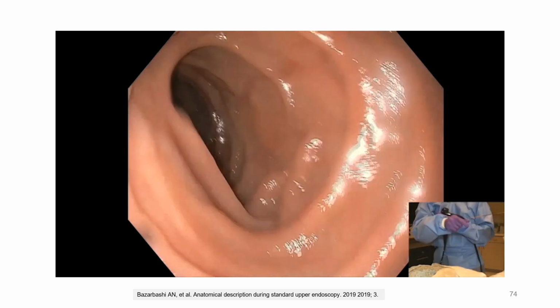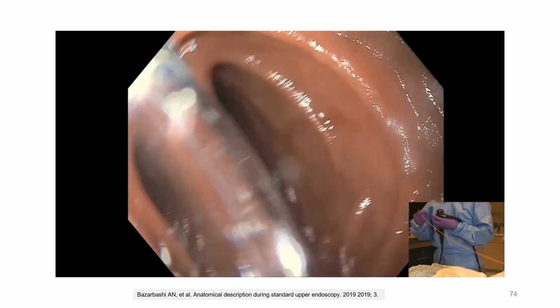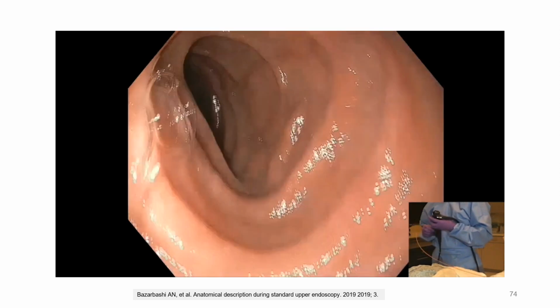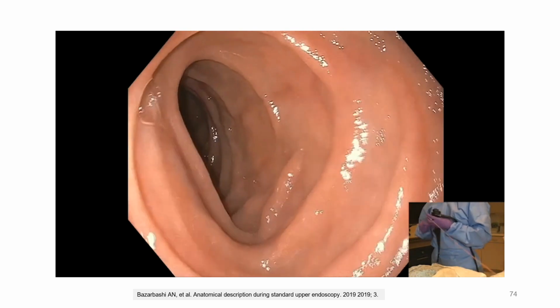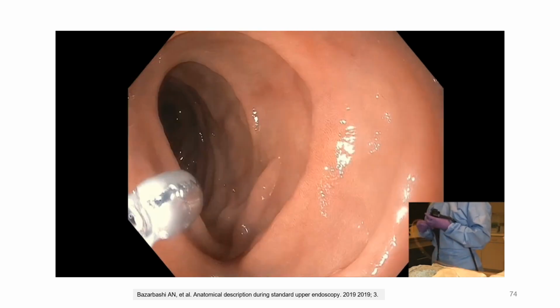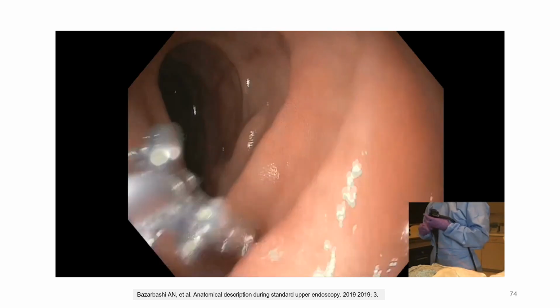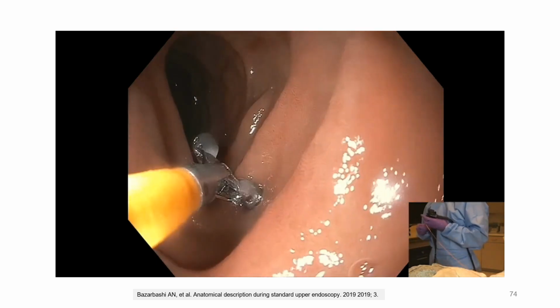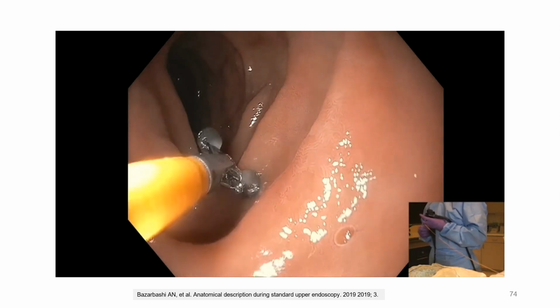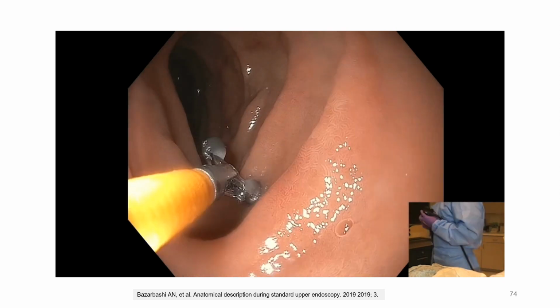The duodenal mucosa is examined for ulcerations, erosions, or scalloped duodenal folds, which may indicate underlying celiac disease. If biopsies are indicated, the biopsy forceps can be guided into the working channel of the scope. Attention should be paid to the speed at which the endoscopist passes devices through the working channel, as it is possible to damage the mucosa as the device enters the lumen.